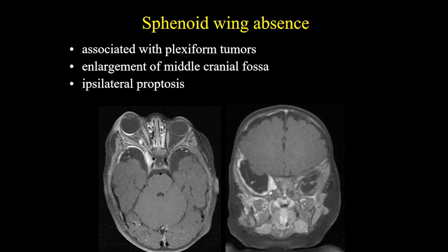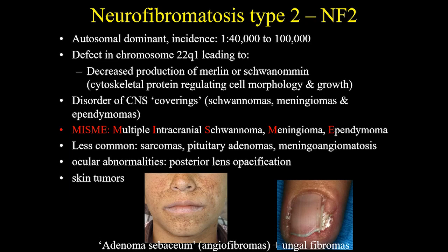Another not so common finding in MRI is sphenoid wing absence, and it is associated with plexiform tumors. You can see enlargement of the middle cranial fossa and sometimes you can find ipsilateral proptosis associated, like you can see in this good example.